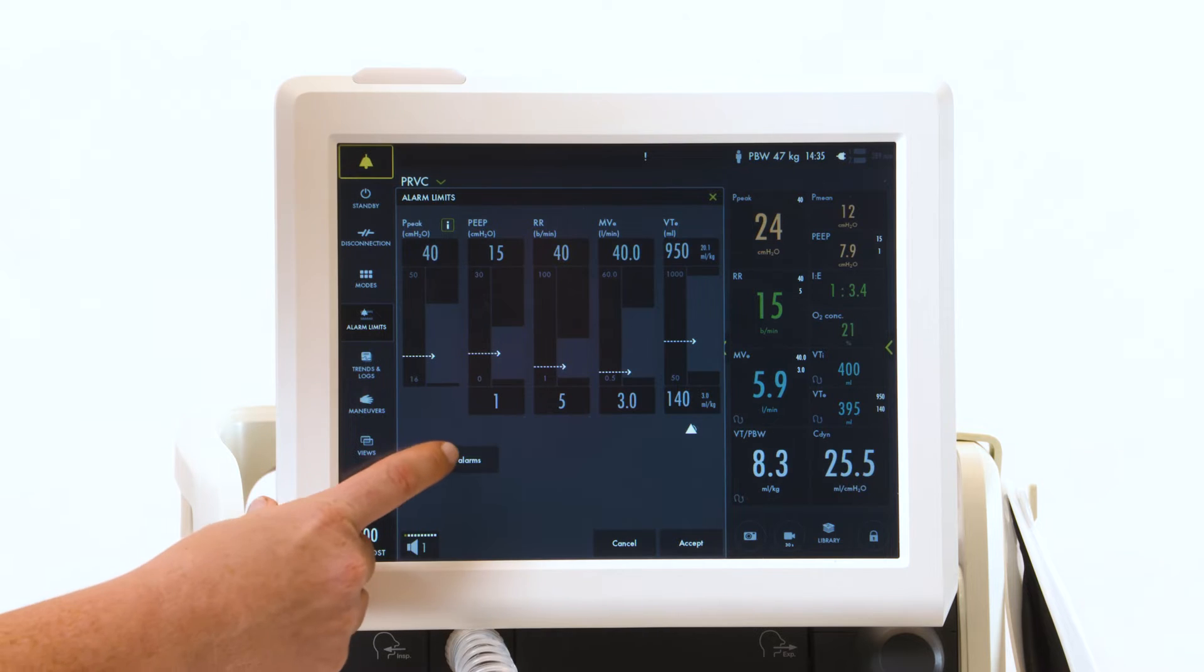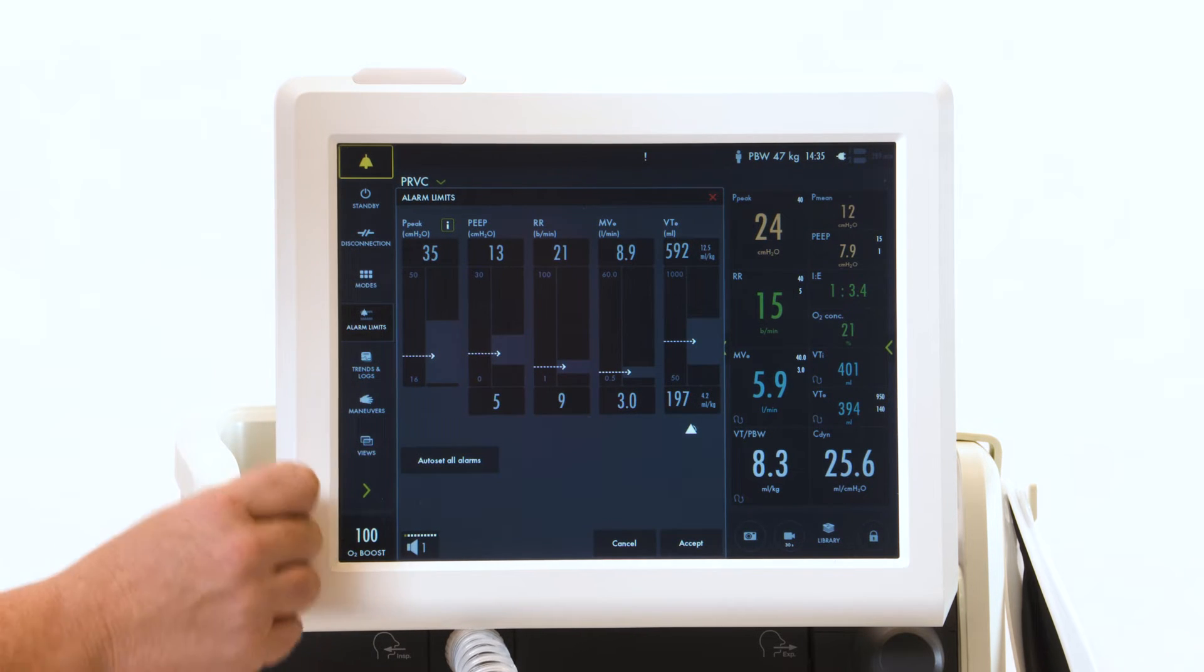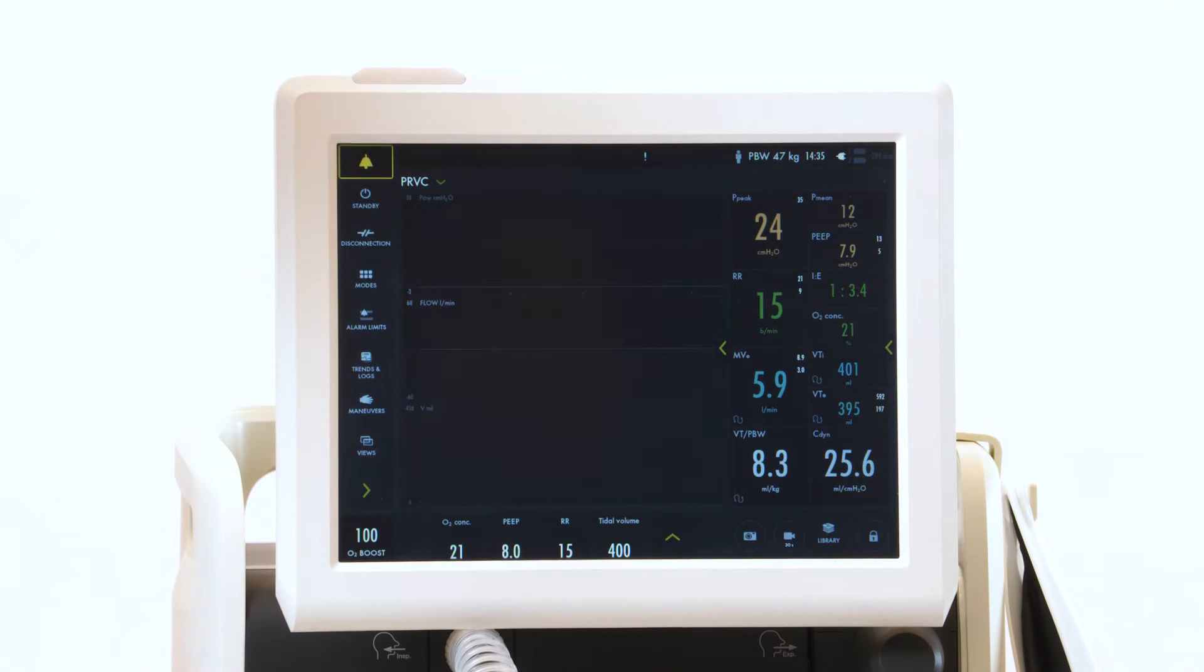There is also an auto-set feature available in control modes of ventilation for the alarms. They will set the upper and lower alarm limits based on what your patient is currently doing. It is located here, and the ventilator will make the adjustment. If you're happy, you then hit accept.